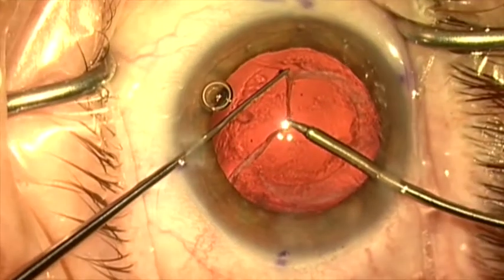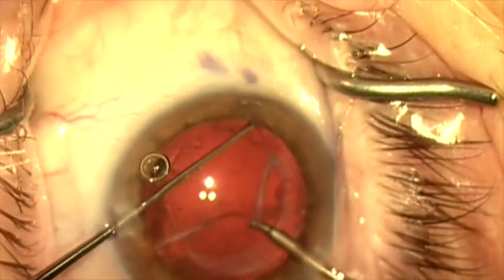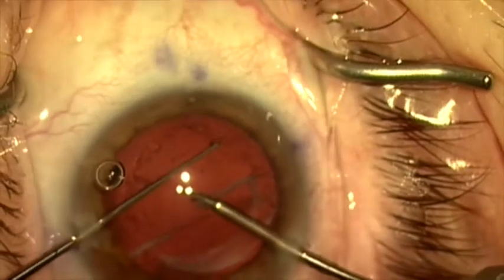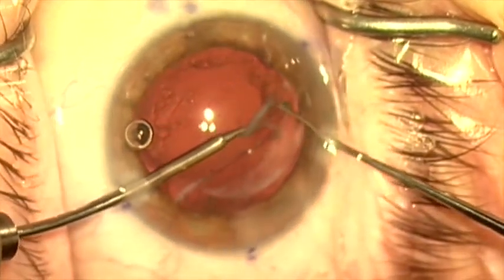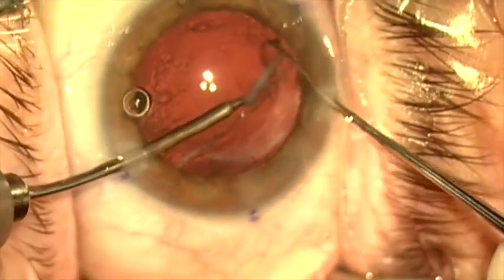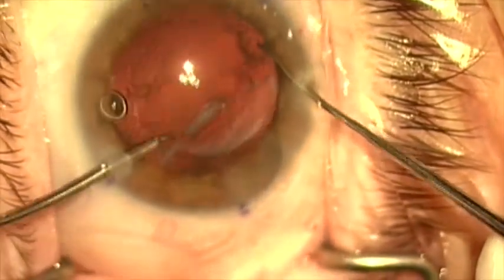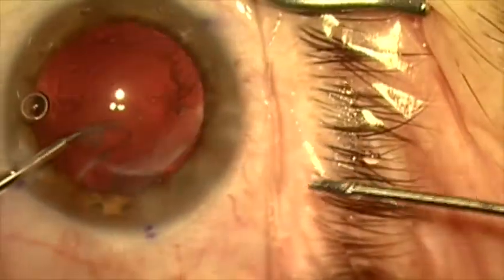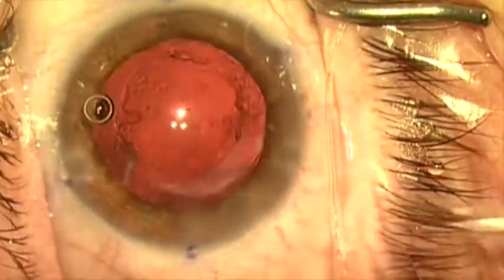I'm retracting with one hand to hold the rim back while I pull the fibrosis off with the other hand, working my way around as much as possible to remove as much fibrosis as I can to freshen up the capsule bag. I'll switch hands — pulling on the fibrosis with my left hand using a micrograsper and retracting the anterior capsule rim while stripping with my right hand using the hook. At this point I realize I'm getting into some really thick and heavy fibrosis, so it's better just to cut this and run. I'll cut this strand, pull it out through the paracentesis, cut the other side, and that finishes refreshing the capsule bag.